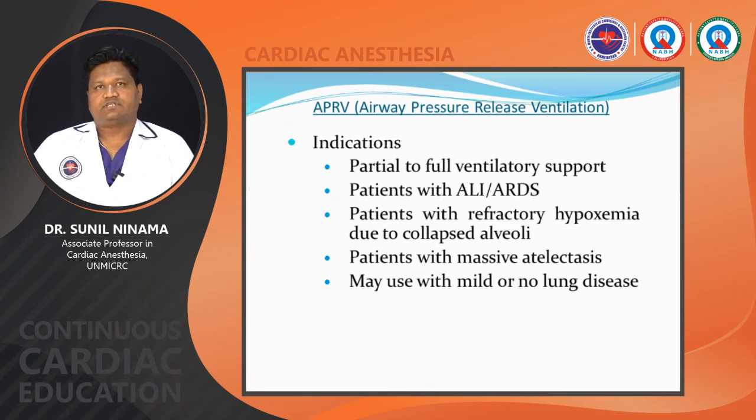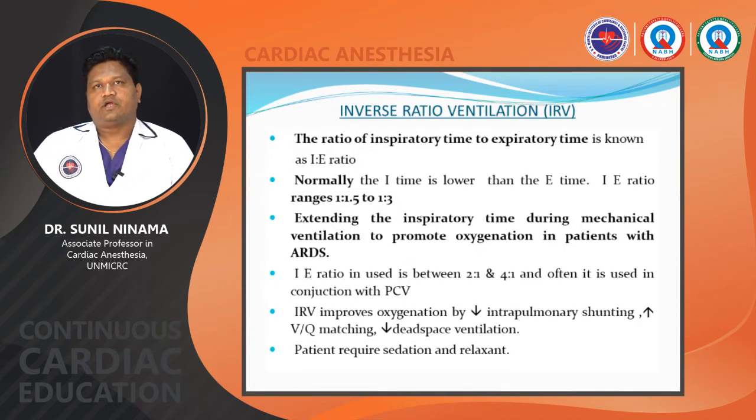The indications for the APRV mode are partial or full ventilatory support, patients with acute lung injury, ARDS, patients with refractory hypoxemia or collapsed alveoli, patients with massive atelectasis, or it may be used with mild or no lung disease. Inverse ratio ventilation. In this, the ratio of inspiratory time to expiratory time is known as the I:E ratio. Normally, the inspiratory time is shorter than the expiratory time. We already discussed these things.